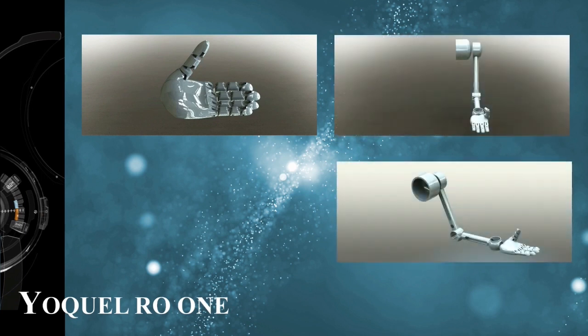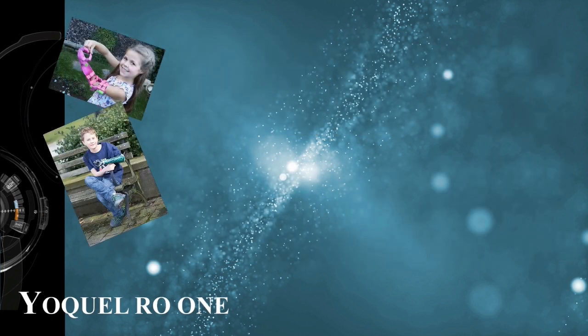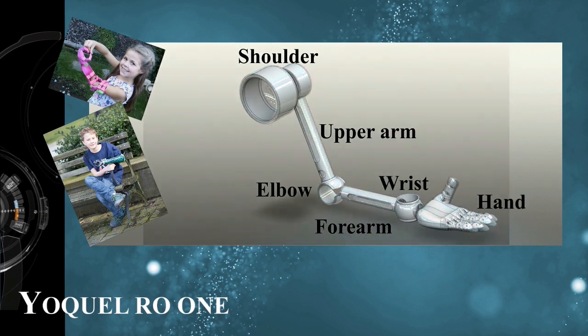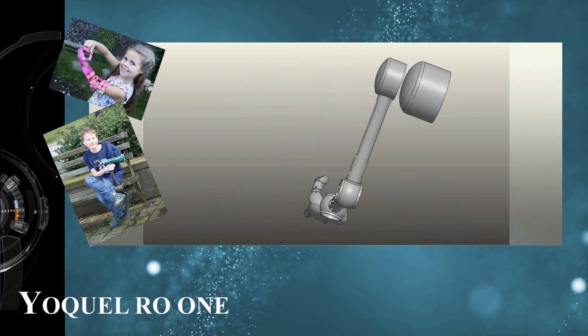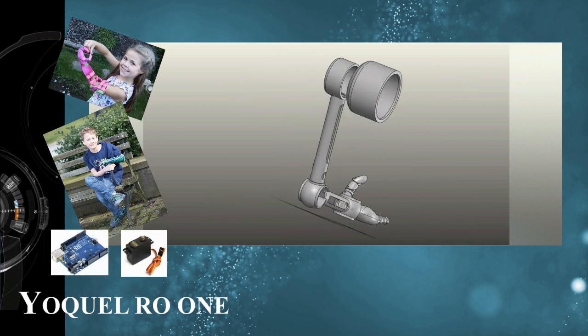YOQUEL RO ONE is a prosthetic arm destined to low-income people, mainly children between 10 and 15 years old. The arm consists of shoulder, upper arm, elbow, forearm, wrist and a hand, which together work with a simple mechanism, moving with 3 degrees of freedom. The prosthesis was built with resistant recycled materials, Arduino board and servo motors.